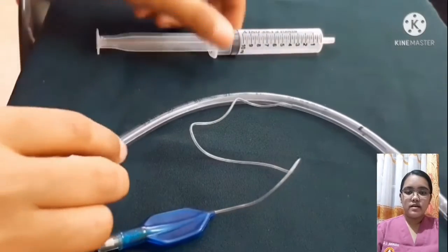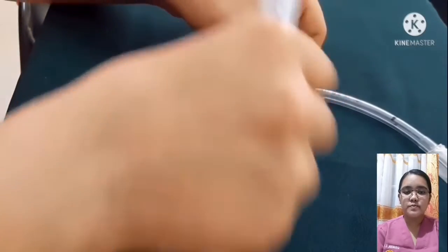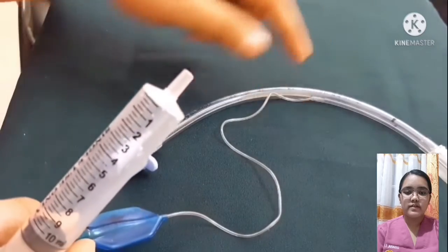Select the appropriate endotracheal tube size as ordered, inflate the endotracheal tube cuff and check if there is any leakage, and deflate the cuff completely.